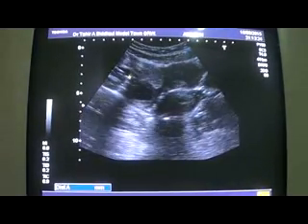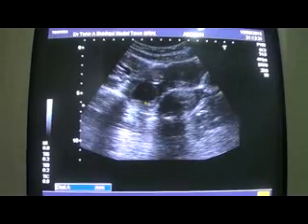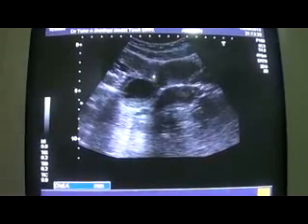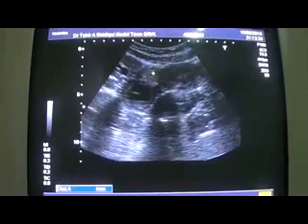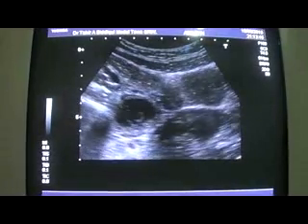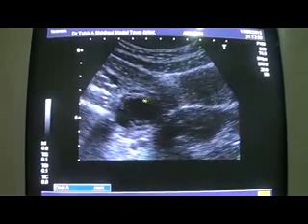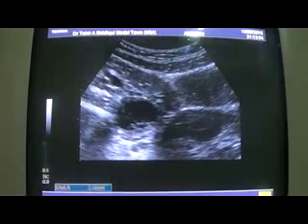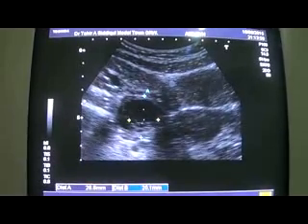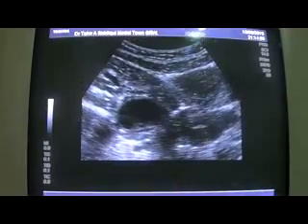the right adnexa, you will see there is a thick-walled cyst with internal settled down dependent region echoes, and there is fluid also seen. These are the bowels, and let's first concentrate on this pathology. This is the cyst, a right ovarian complicated cyst with dependent region echoes measuring approximately 29 by 30 mm, with a thick wall.